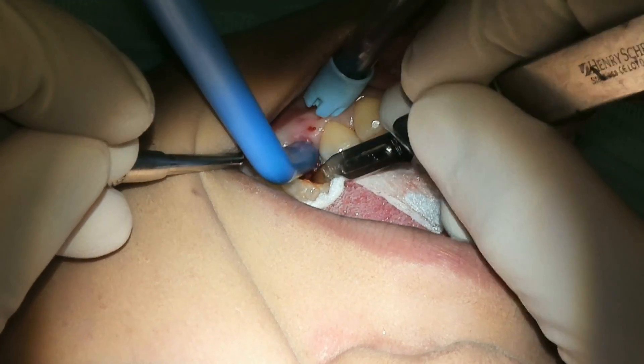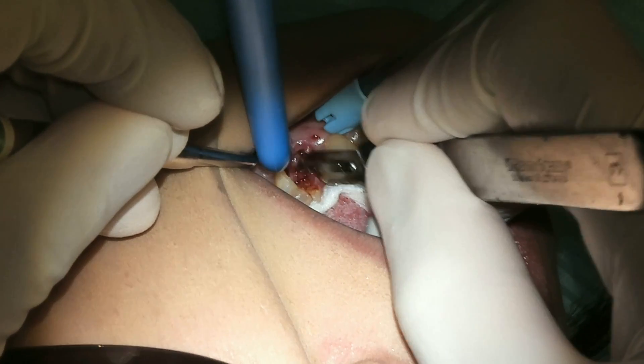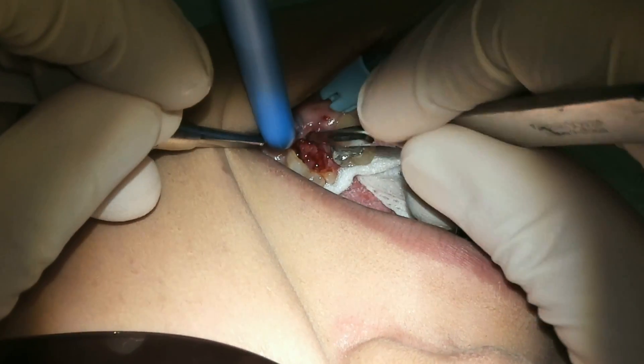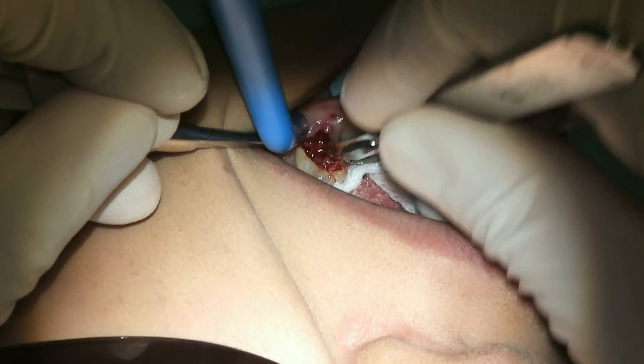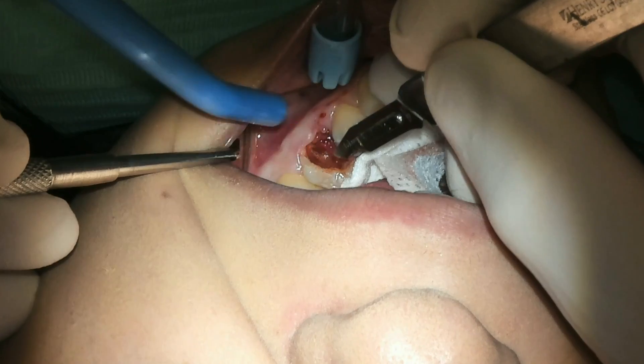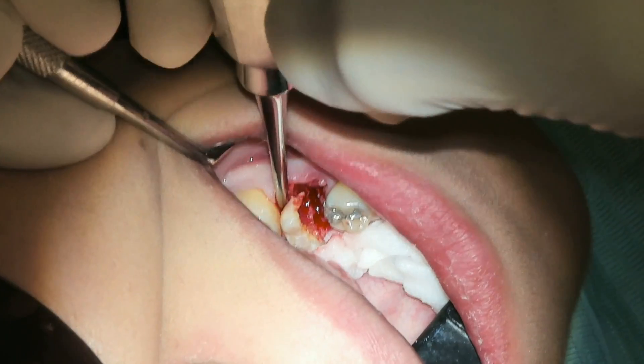So I bring out a surgical handpiece and section the tooth in half. I don't have to section very much because the mesial root and the distal root are hanging by a thread. But I do need to section it that way instead of forcing it through with any other instrument.